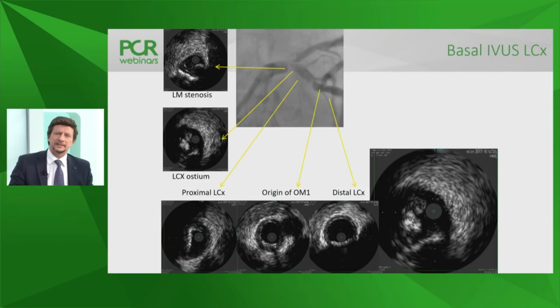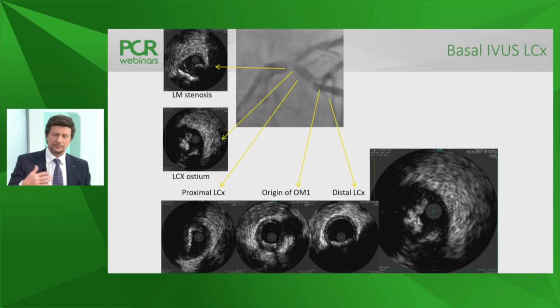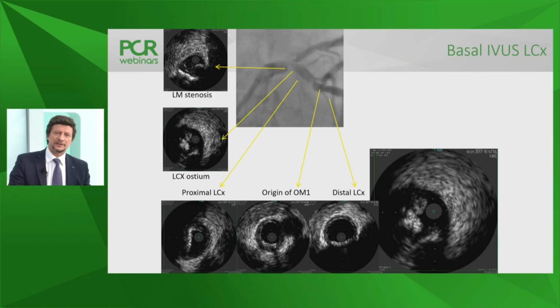Flavio, how did this intravascular imaging impact your decision? And I want to reconnect with one of the questions from the colleagues. In other words, were these images convincing to you to choose, for example, rotational atherectomy over cutting balloon, because cutting was one of the questions of the colleagues, or you had already your idea clear in mind before doing that? No, definitely. There is a really very tight MLD before the bifurcation of the left main. Think about this. This will be an issue of discussion on how to rotate this lesion. There is a lot of calcium in the bifurcation.